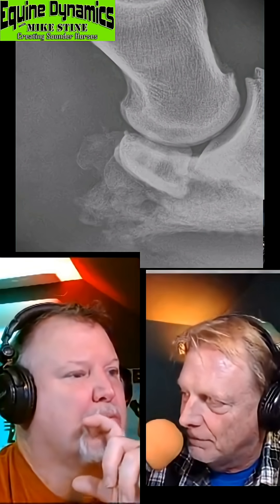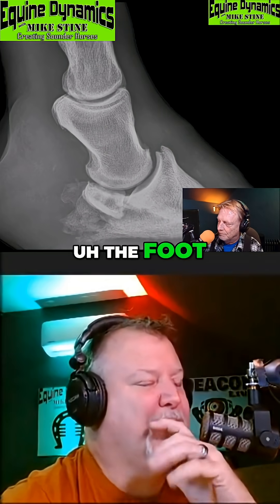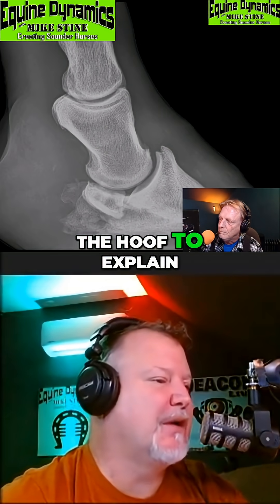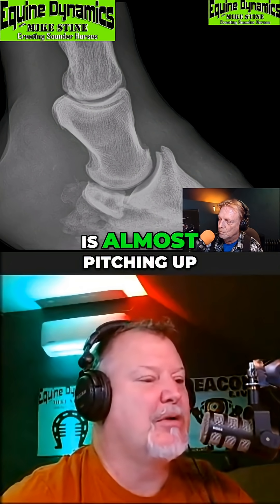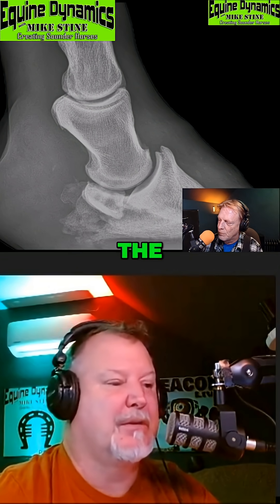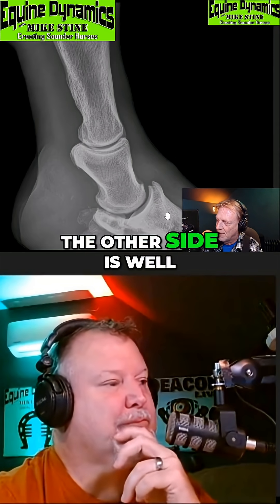So it's not laminitic. To explain for everyone who's not watching the video: the hoof is pointing into the ground, but the coffin bone is almost pitching up a little bit — toe up. Okay, and the other side is actually a little worse.